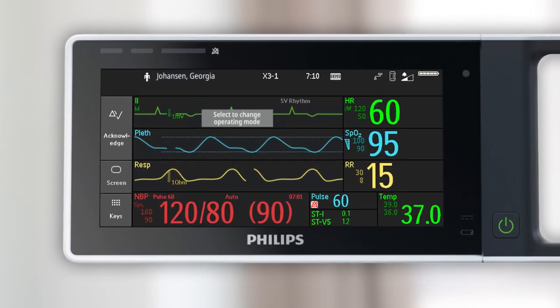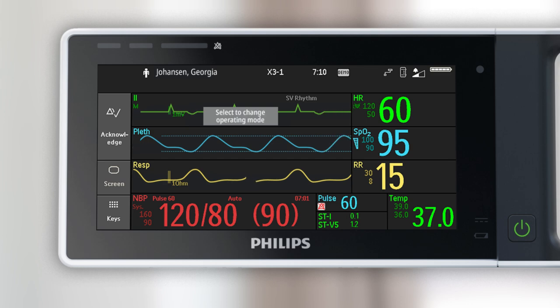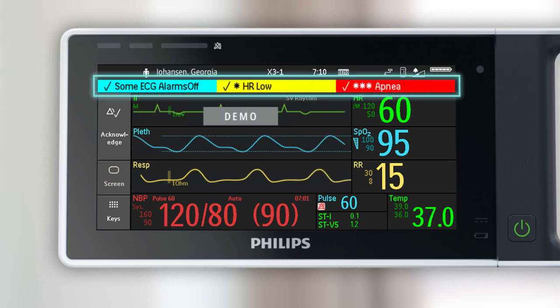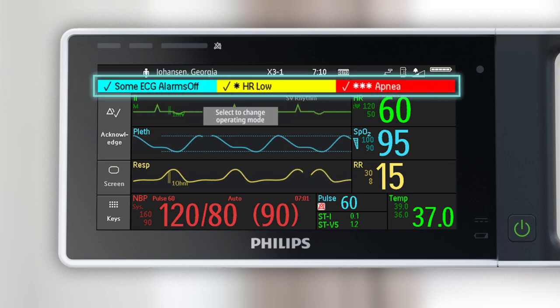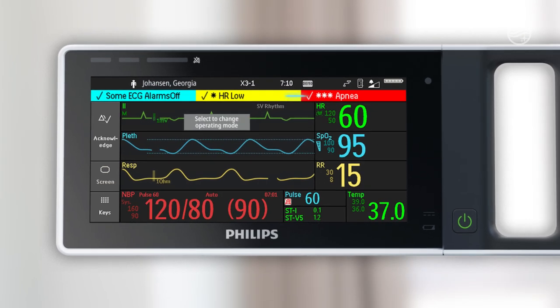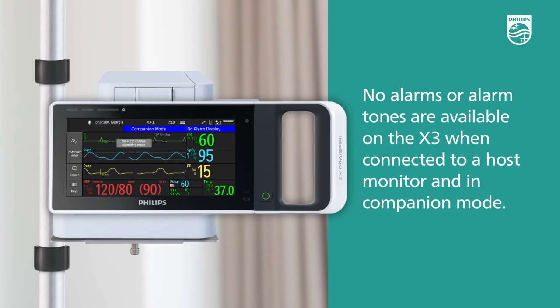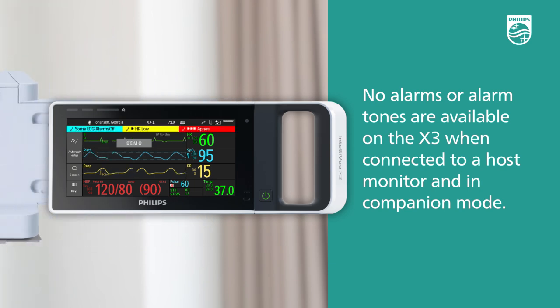The X3 screen consists of many of the same elements as other Philips patient monitors. The area beneath the information line displays alarm messages, in-op messages, and alarms off or alarms paused messages. No alarms or alarm tones are available on the X3 when connected to a host monitor and in companion mode. Alarms become active again as soon as the X3 is disconnected from the host monitor.